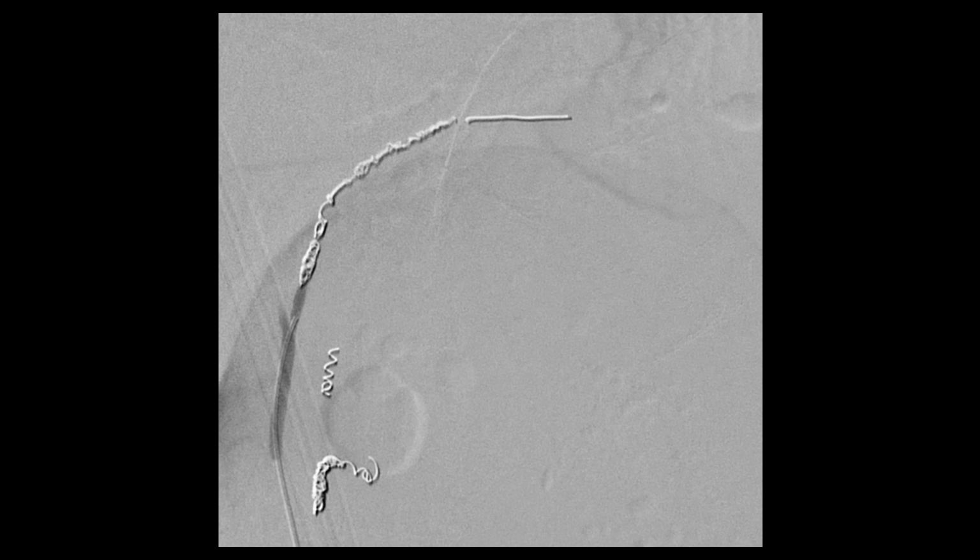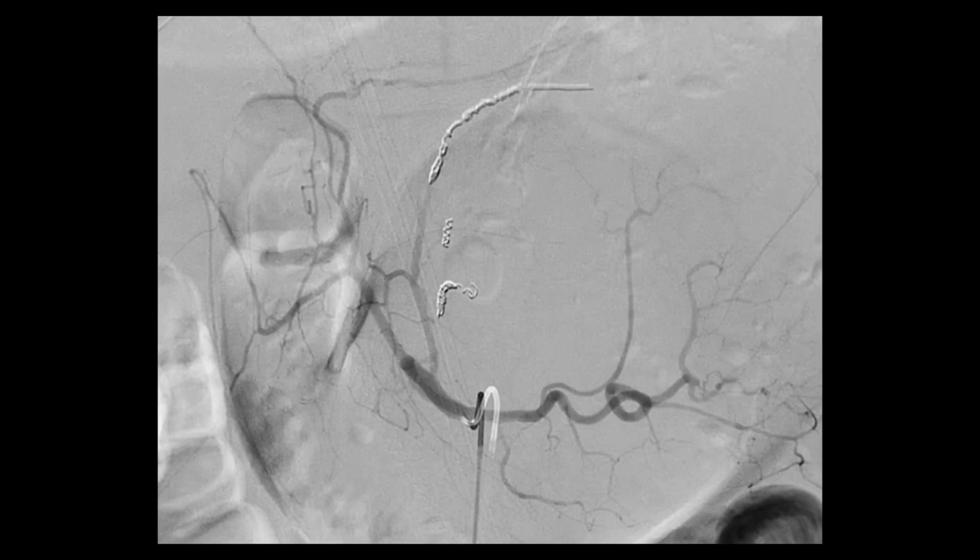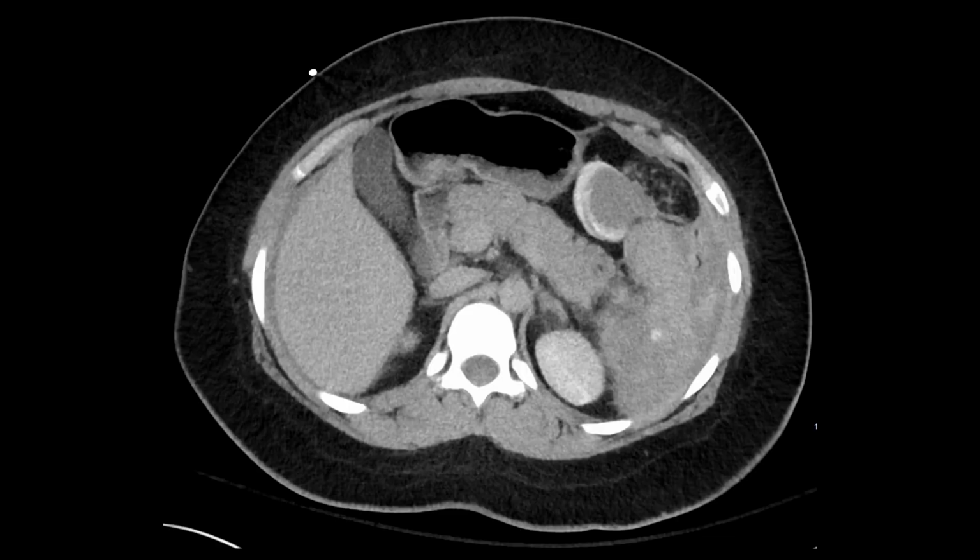the site of bleeding. This is important because if it's not an end artery, meaning if the artery doesn't just supply a small area of parenchyma, that means it's going to have the possibility of retrograde flow into that vessel, and then it can back bleed, which we don't want to deal with. So if the bleed is here, we want to make sure we have coils on both sides, so we stop the flow from both ways, and then we stop the bleeding, which makes me happy. So this is our final image here, follow-up. This would be a celiac artery angiogram and no more bleeding to the stomach, which is good.